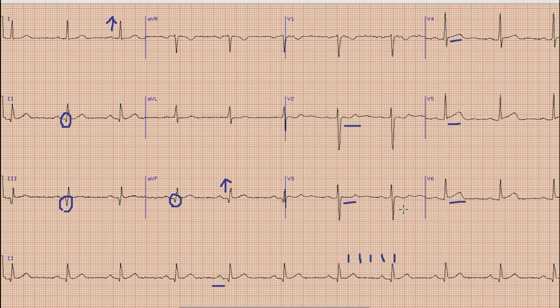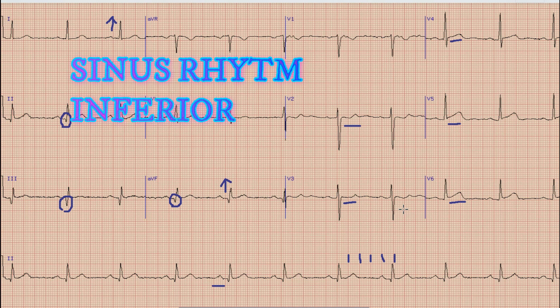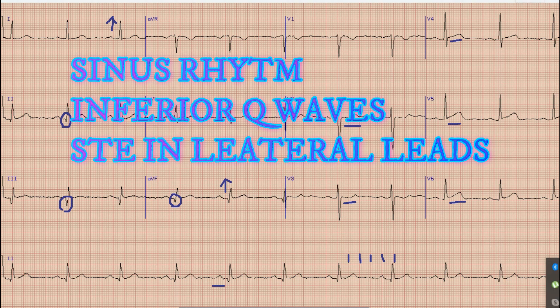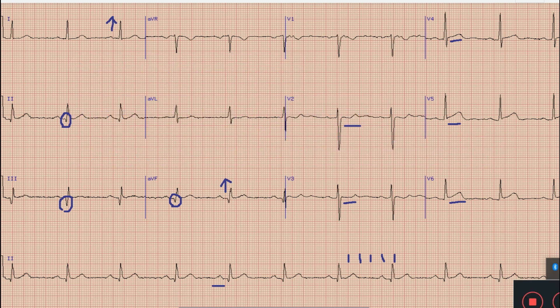So if we sum up the findings: there is sinus rhythm with normal axis, and there are Q waves in inferior leads indicating the history of previous inferior wall MI, along with ST elevation in lateral leads, which means that there is an ongoing ST elevation MI in the territory of the circumflex artery.